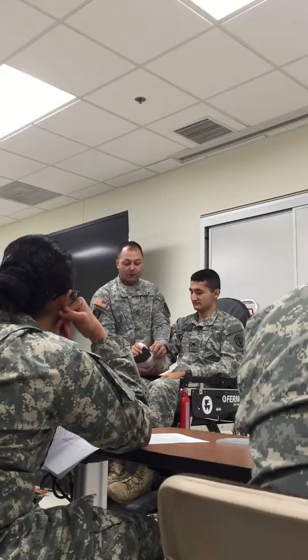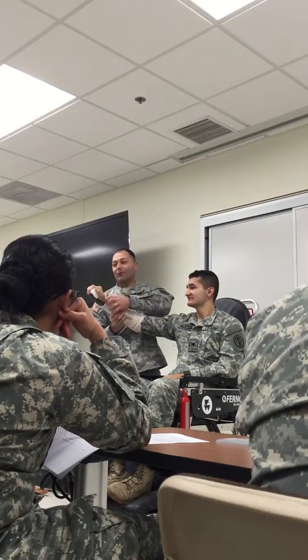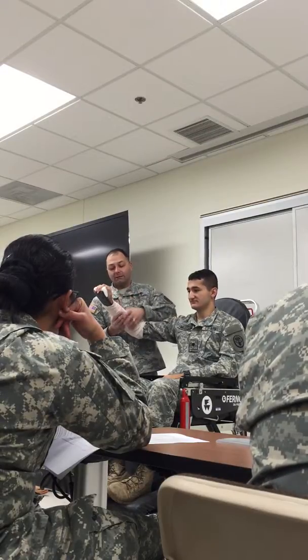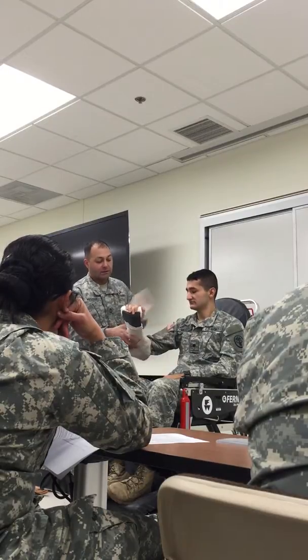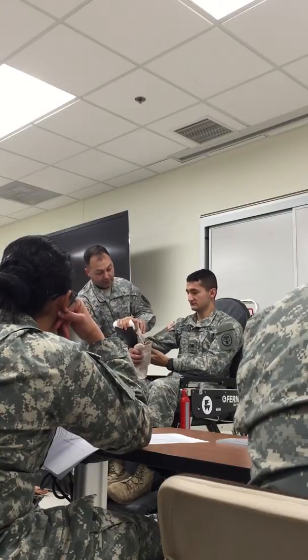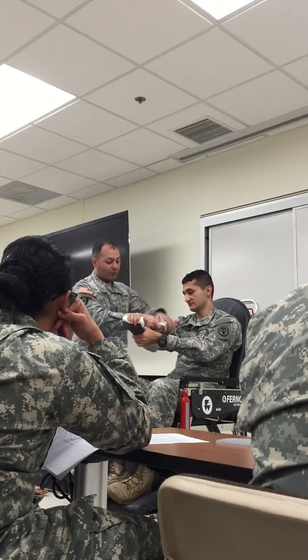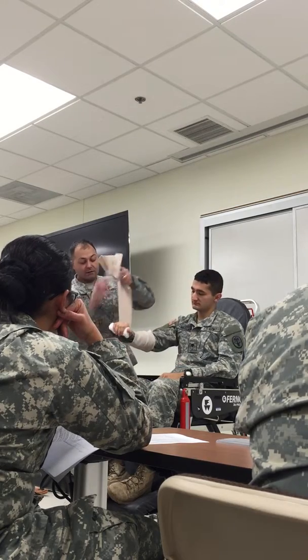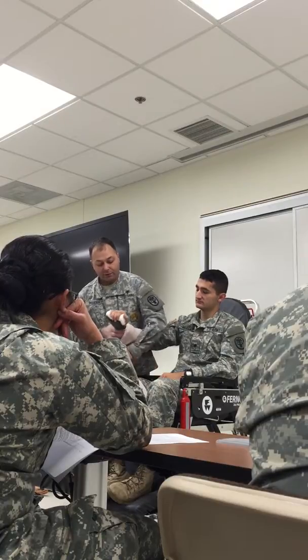And I have a nice little window where I can roll this back and check and assess my pulse. I started at the hand and worked my way back. You can even go the other way. Start at the elbow and work your way forward. And it doesn't matter if you cover the break with the ACE wrap because it's a soft, pliable material.